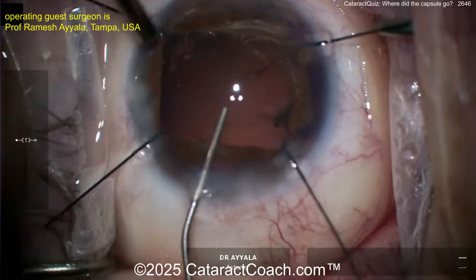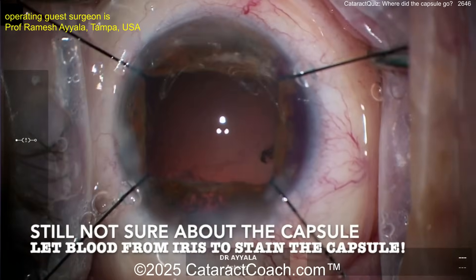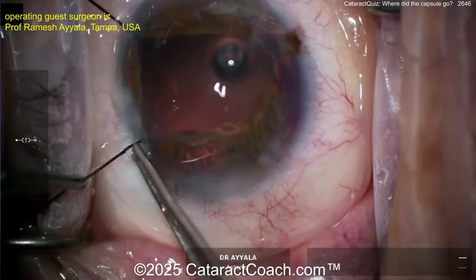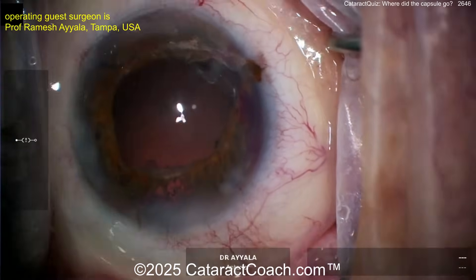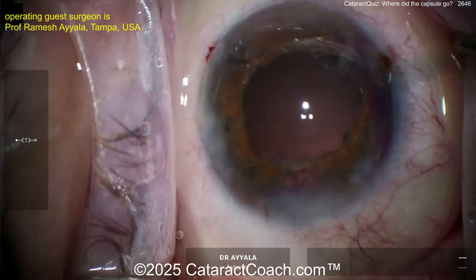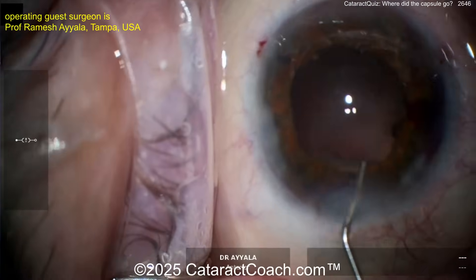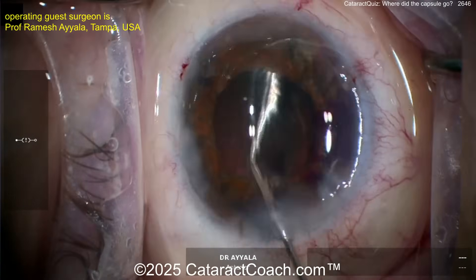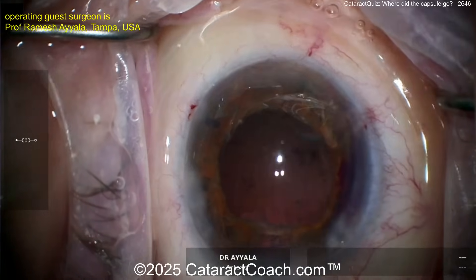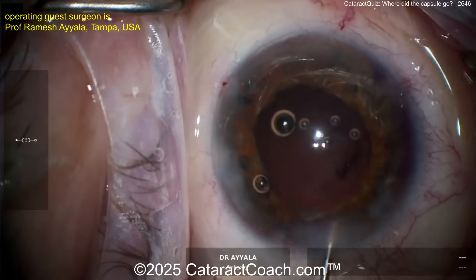Doesn't look like vitreous. Here comes a very intelligent move — I've never heard of this before. Now using some blood from the iris to stain the capsule. Look how smart this is — this is brilliant. Taking out the iris hooks, letting the iris come back down, getting a little bit of that blood on top of the iris and letting it seep down. Put a little visco to help push it out of the angle and let the blood flow down. There it is — now look. That tiny bit of blood can help stain and show the capsule. It's actually resting on the capsule, staining it — so now you know the bag is intact.